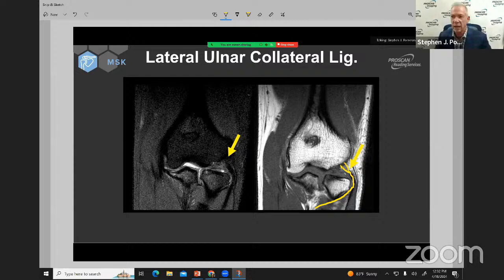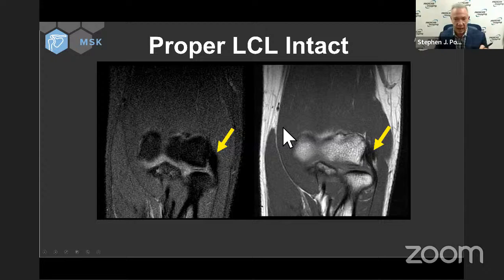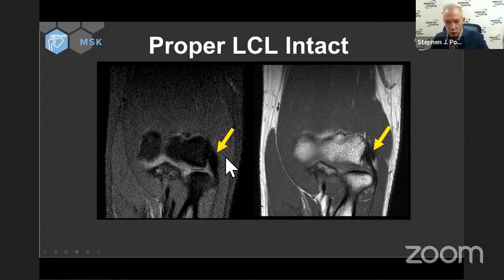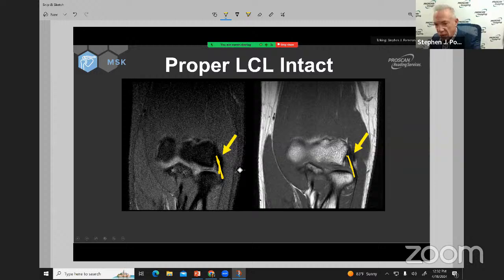Now compare that, you're in the back now. These are both pictures of the LUCL. It's a little clearer on the T1 than it is on the STIR, but then have a look at a more anterior slice. The more anterior slice shows you the fat, stubby cigar in its mouth of the radial collateral ligament, the proper collateral ligament going from the humerus to the radius. So that one's intact. So this was a pure LUCL injury.